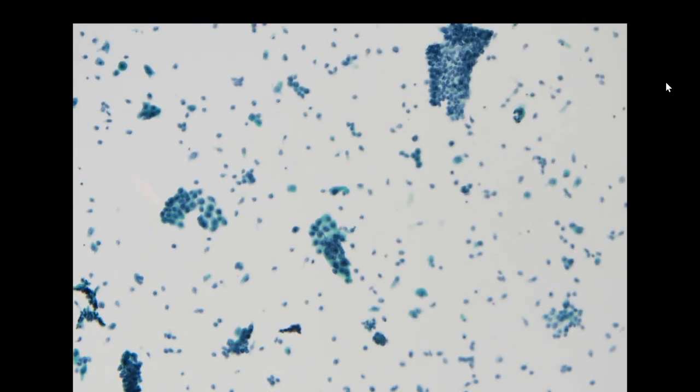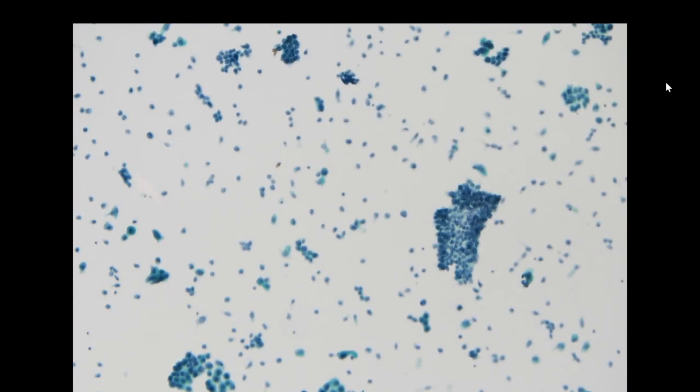But the cytomorphology is not very distinctive among these different tumors. And to be honest, the pathologic examination is also very subjective. So sometimes we would just use low-grade urothelial neoplasm as our category.